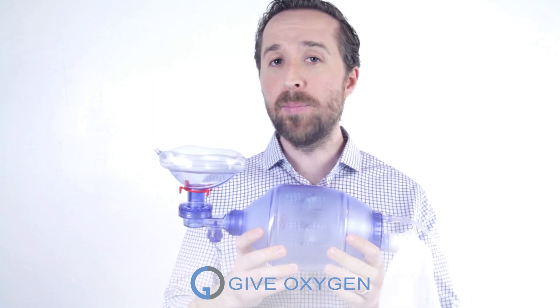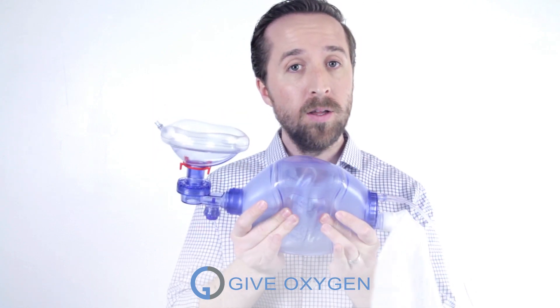If the patient isn't breathing, it pumps oxygen into the patient's lungs on the inhale, and on the exhale, it pulls out carbon dioxide.